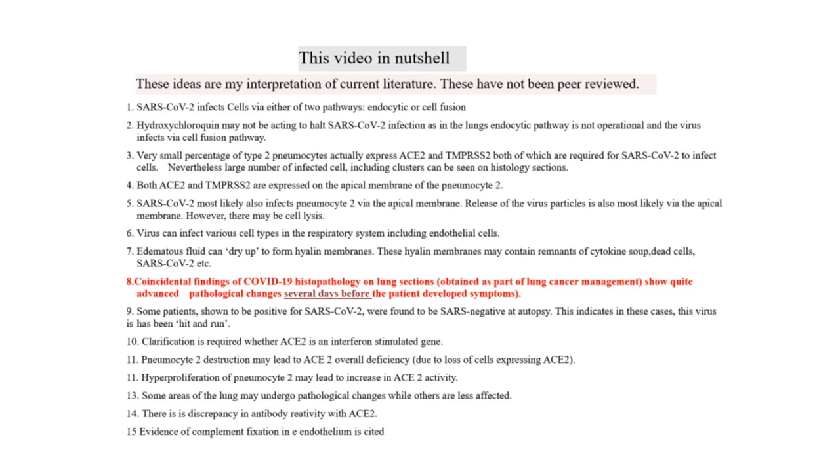This is a list of the things I shall be discussing in this video. I think I've got most of the things listed here. Maybe some things are missing.